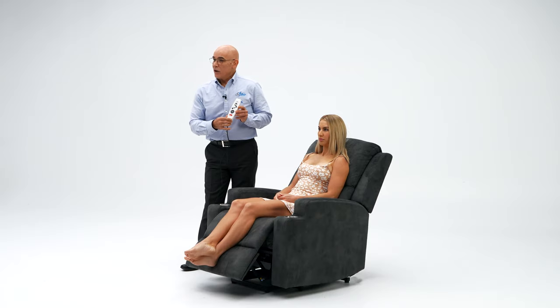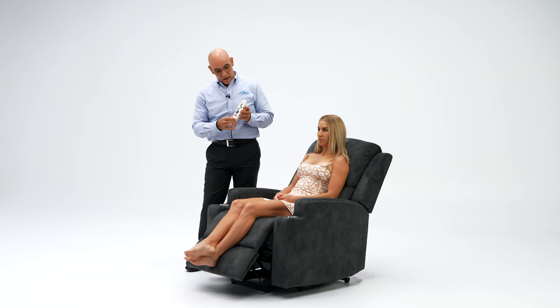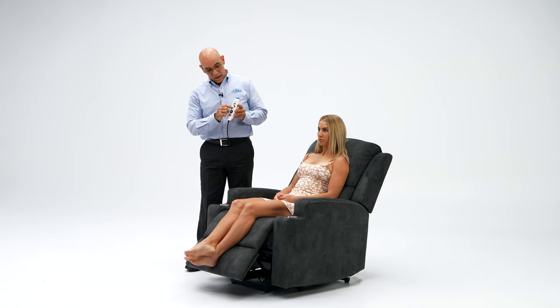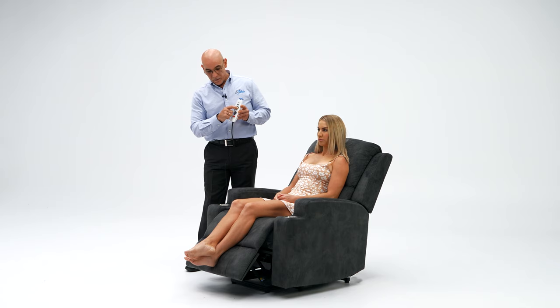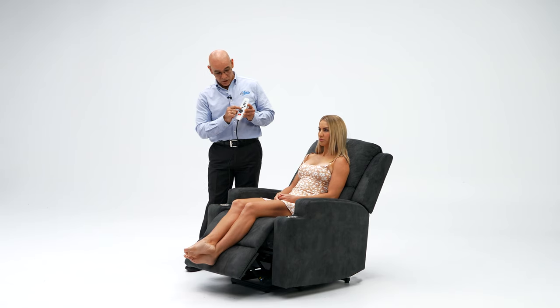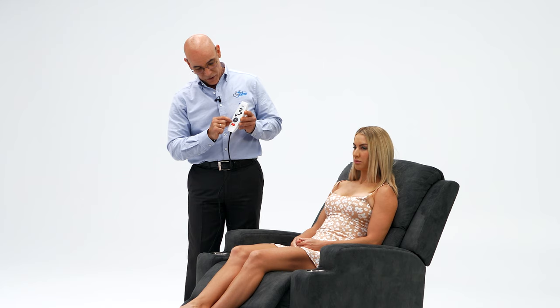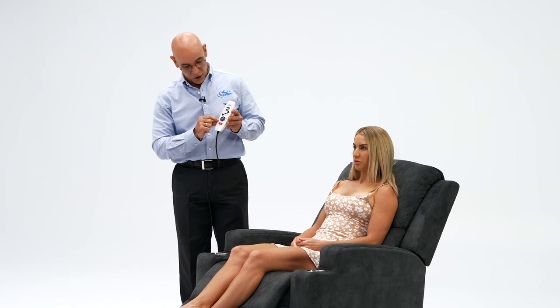Our therapeutic lift recliner chair comes with a very easy and friendly-to-use remote control. It has the quick lift button, the quick recline button, and the lift and recline button with millimetre increments, so you can find exactly where you're feeling perfectly comfortable. It also has the heating buttons and the vibration therapy button with three options for automated switch-off: 10, 20 and 30 minutes.